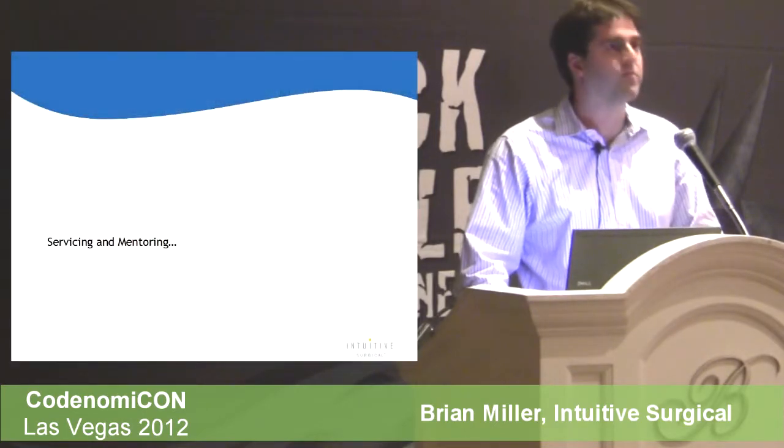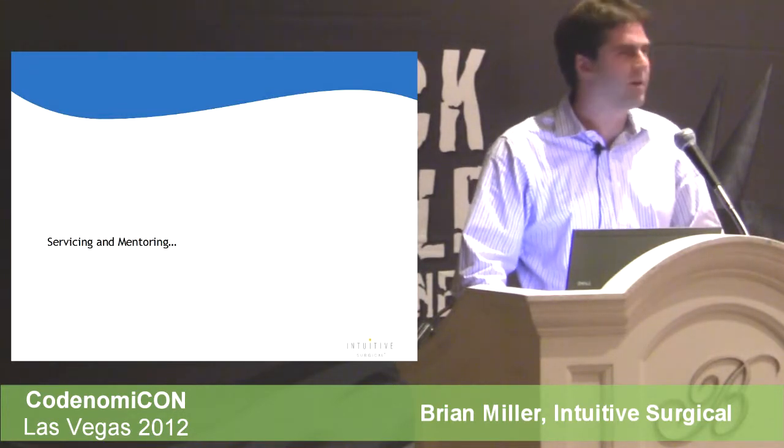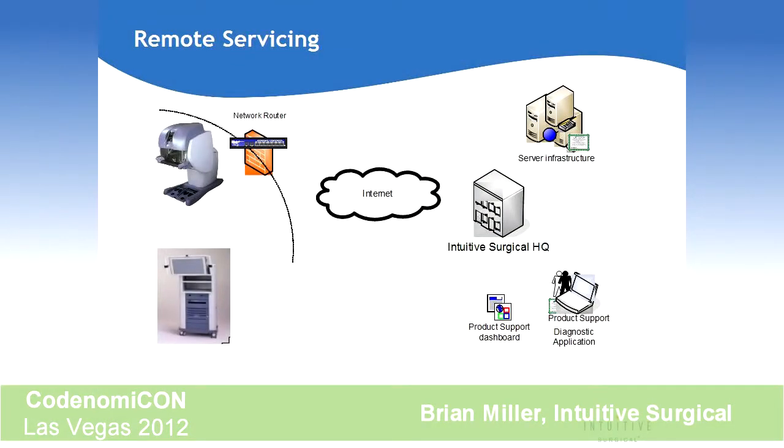So now I want to focus on some of the capabilities that we have today, and unlike some of the telesurgery activities which were done in small numbers, we've got now a servicing network. We've got over 2,000 robots installed worldwide. I think our servicing network is up to over 1,800 right now, so our devices are constantly communicating in, and it gives our customer support team the ability to understand what's going on. They've got a product support dashboard, as you see on the right-hand side, that they can connect in. They can see what systems are communicating. They have some diagnostics application that they can go in and understand what's going on with the system. It's had a pretty dramatic impact on our business and how we service the systems.